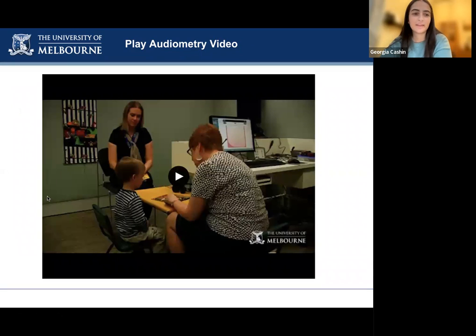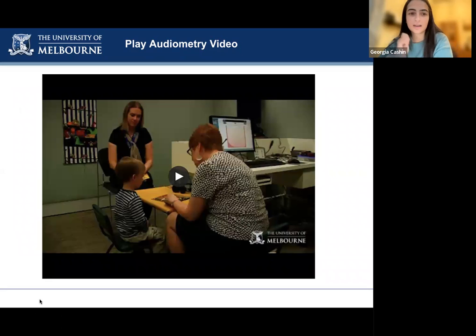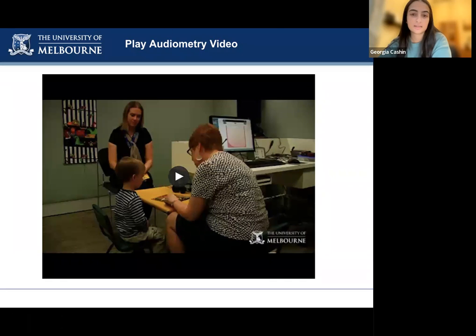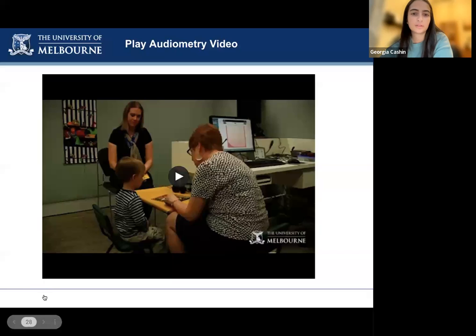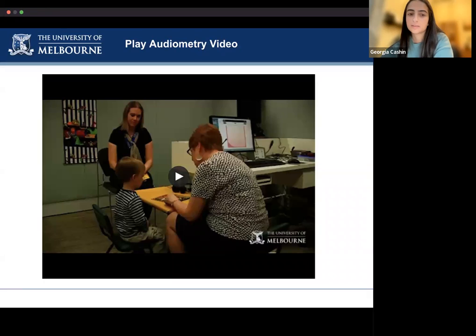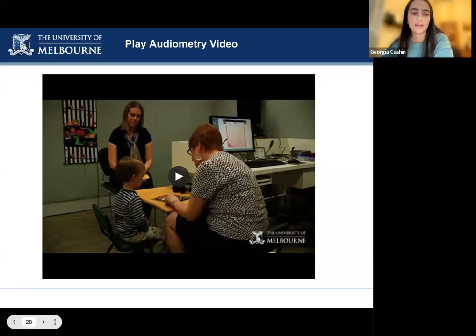As you saw in the video, the child would take the headphones off every time he heard the sound — we can take this as a response, as long as it is consistent throughout all of the testing. We'll now move on to Jack going through some different types of responders and some tips and tricks.